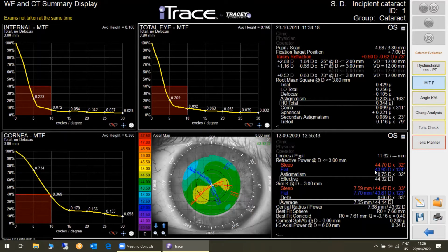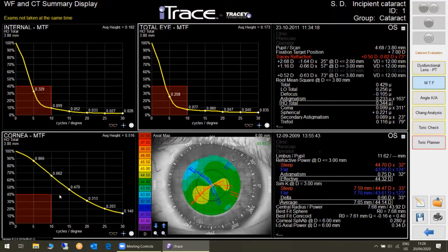I very often hear 1 diopter, 1.2, 1.25, but if you follow the literature and you see the presentations on the podium, you know that they are starting to talk about 0.7 for multifocals. So can I show you what happens if you take away the astigmatism here? I click on this button, and now you have enough margin to allow a multifocal.